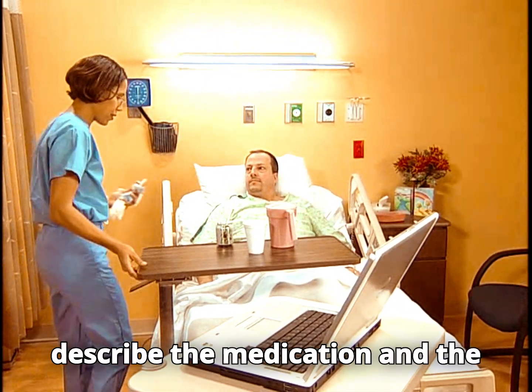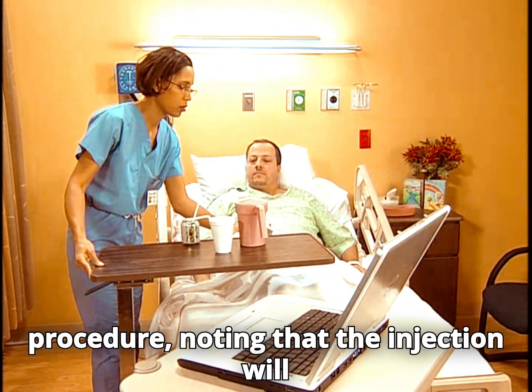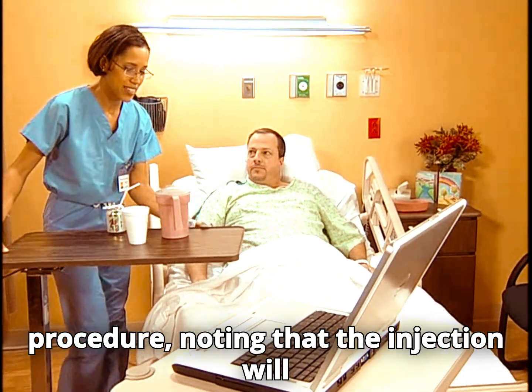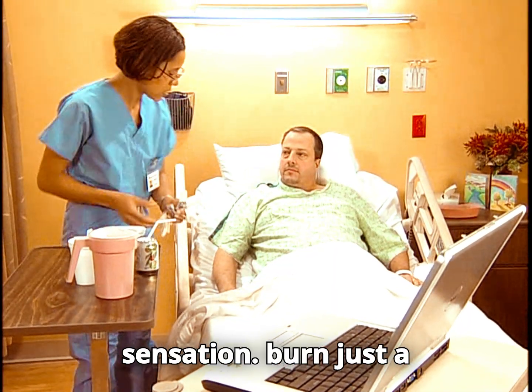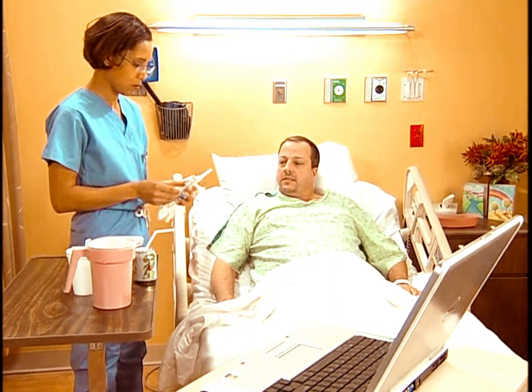Also, describe the medication and the procedure, noting that the injection will cause a slight burning or stinging sensation. It may sting or burn just a bit.